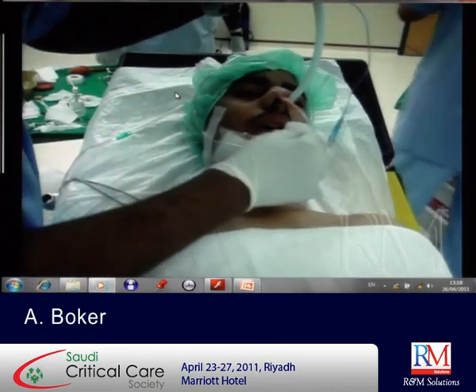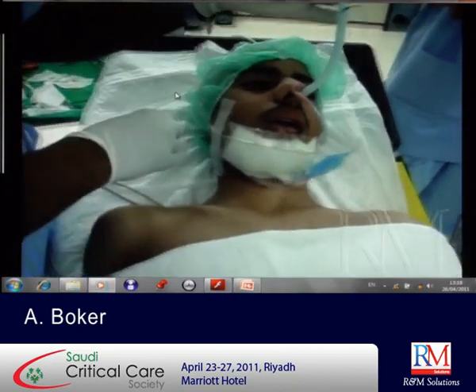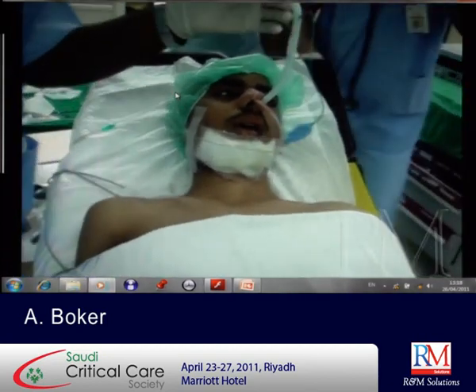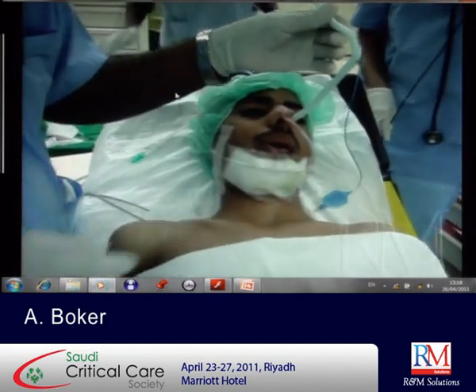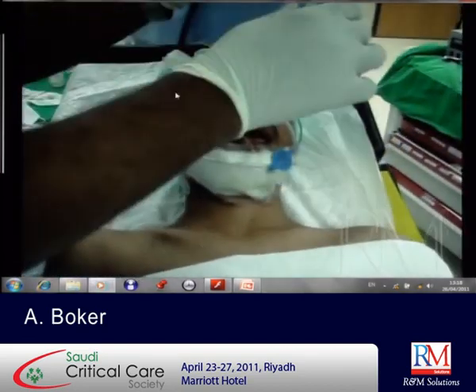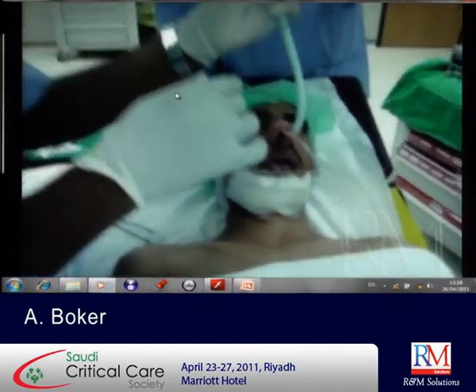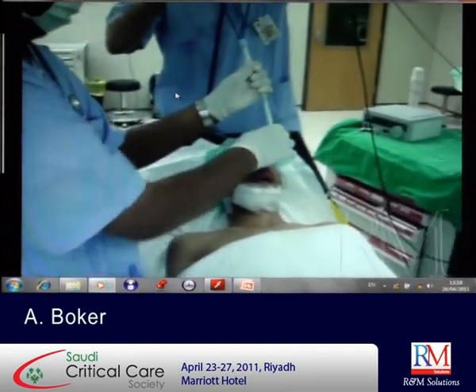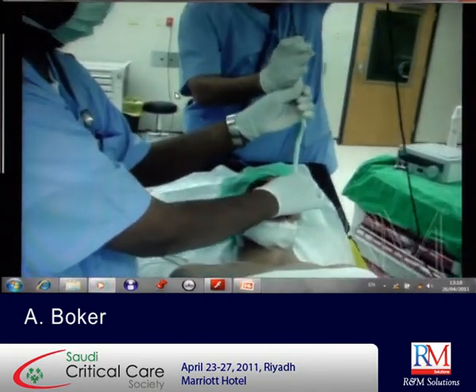It's if you are competent, if you're comfortable with it, that you communicate to the patient. If you listen to what I was saying to him, of course I'm giving him a little bit of midazolam, just a touch, like 2 milligrams, and then talking to him. If your voice is calm and you speak to them step by step, they will not be scared.